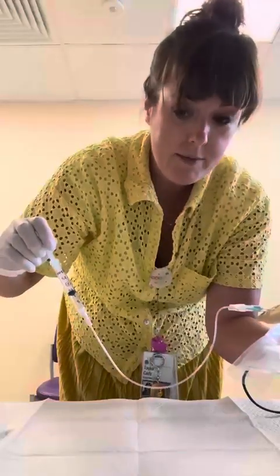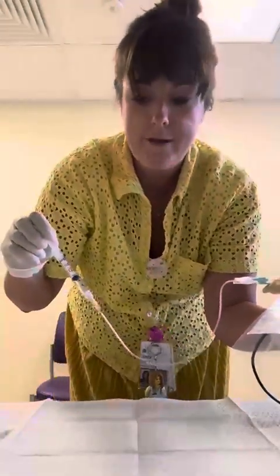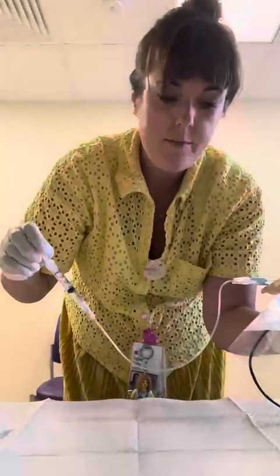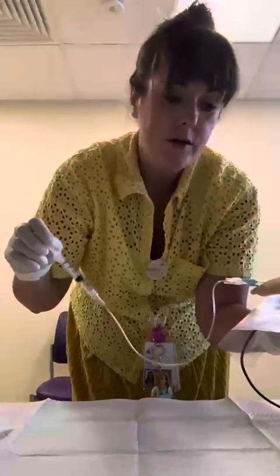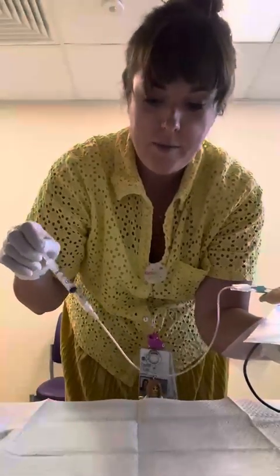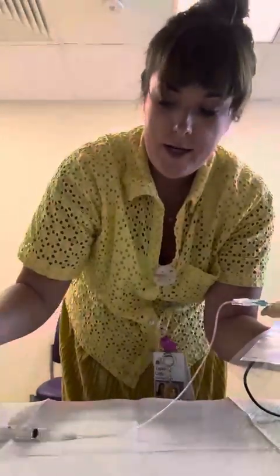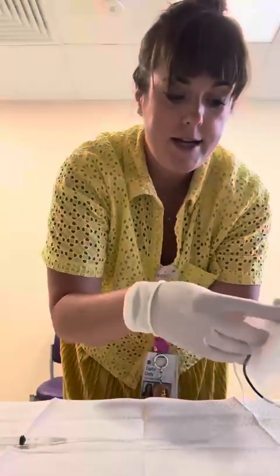Hopefully you're going to get 1 ml of blood. That is the blood volume that you need for a blood culture. Minimum is 0.5 mLs, but 1 ml is the right amount for not bloodletting the baby, but also getting enough for the culture to be able to grow. Okay, so I've got my blood. Got to be really careful here not to stick yourself. Hit the black button, retract, and then keep this all sterile.